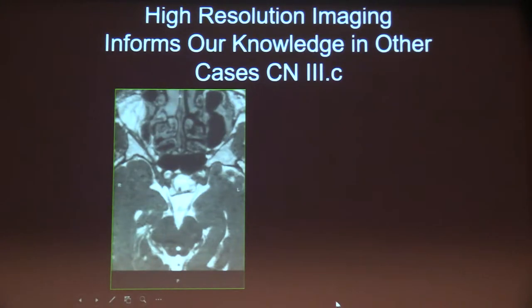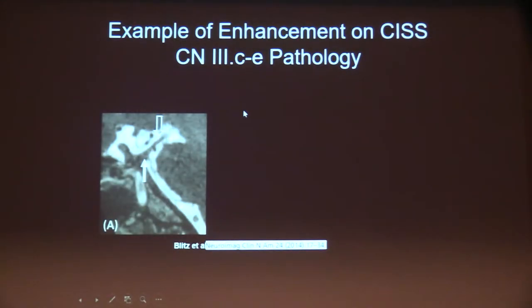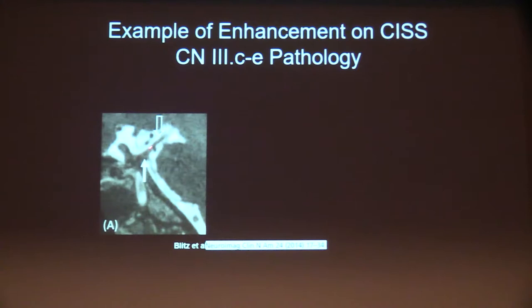Here are some anatomic images demonstrating the third cranial nerve, the CN3C segment. You can see the oculomotor nerve extending anteriorly through the cistern, just medial to the uncus, and in the coronal view below the posterior cerebral artery and above the superior cerebellar artery. Here's a pathologic case — a sagittal view with the posterior head on the right of the screen. This is the midbrain, pons, and medulla. In the distal cisternal segment, the nerve fans out, changing diameter from about 1.5 mm to about 2.5 mm — a change only detectable with thin-section high-resolution 3D imaging.